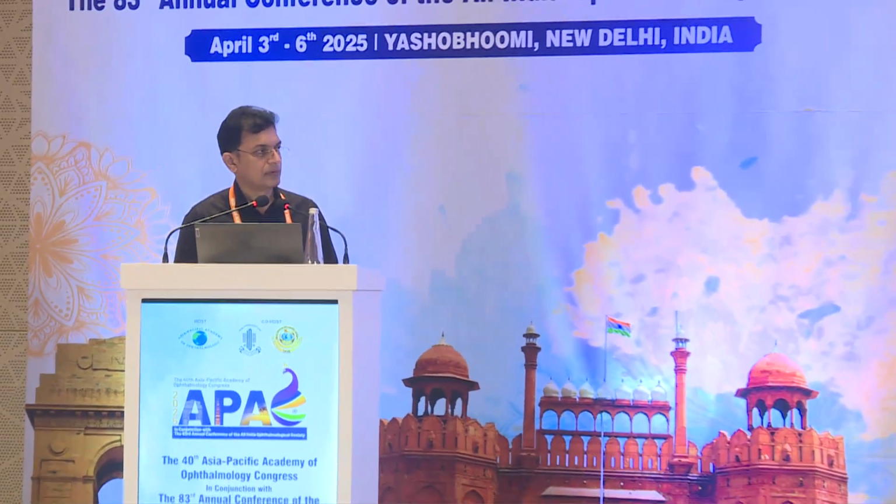Can we actually, on the table, use the online calculators for post-refractive surgery cases? Do you do it routinely, to confirm that whatever we have got in the post-refractive surgery cases is correct? See, that's true. The problem with online calculators for post-refractive surgery is that if you have a very nice central ablation, it's all right.